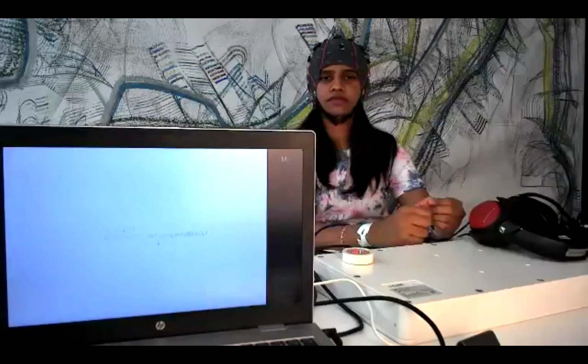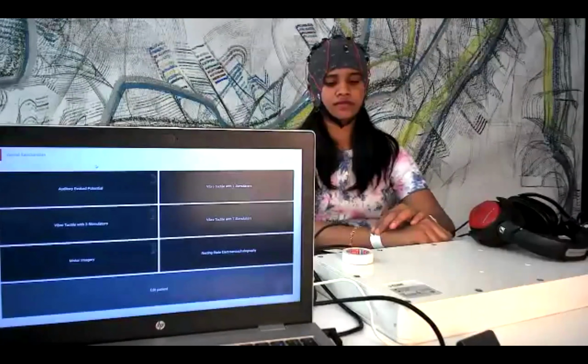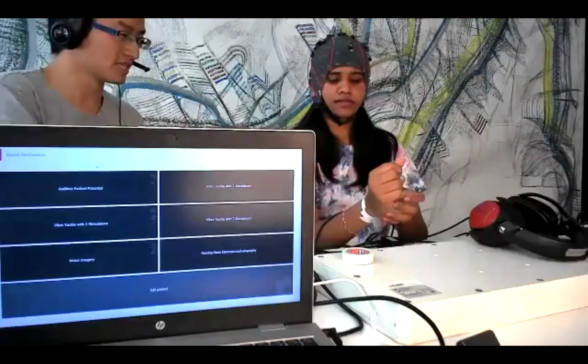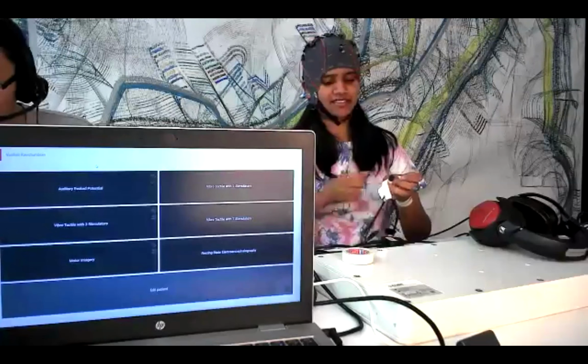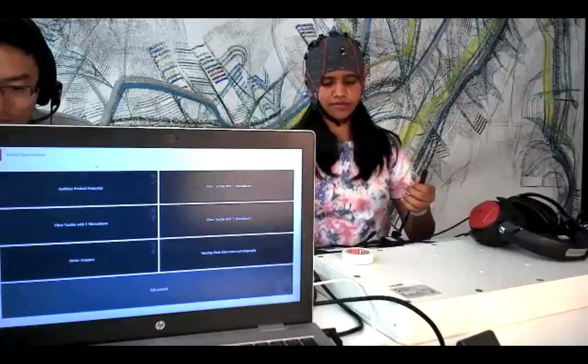Okay, so I will just stop the live demo here, and I will come back to the seat. So I will also let you release. I will change to, let's say, my camera, so I can maybe take a look.